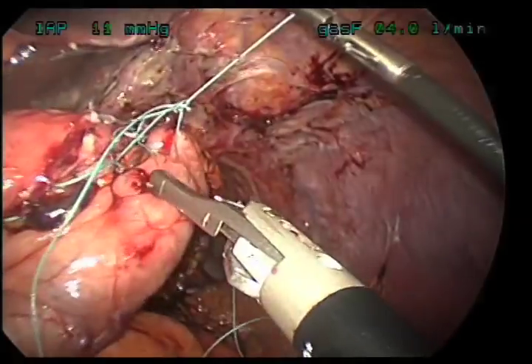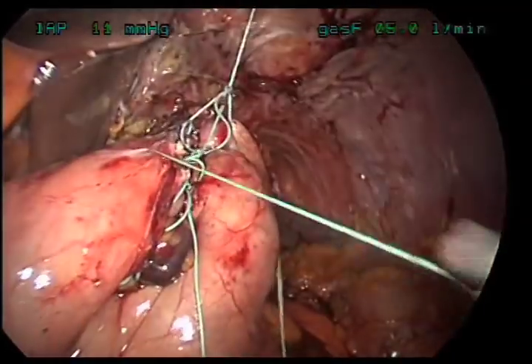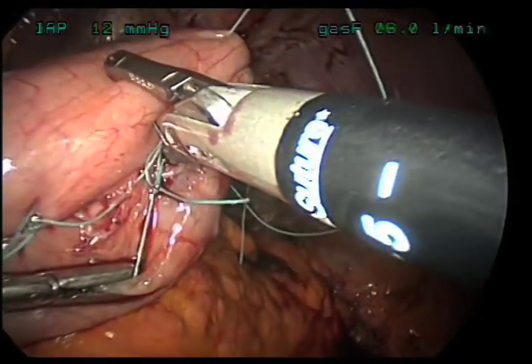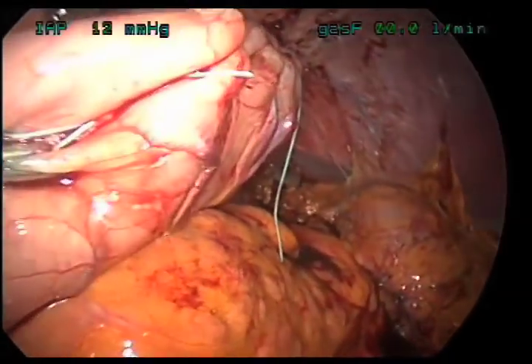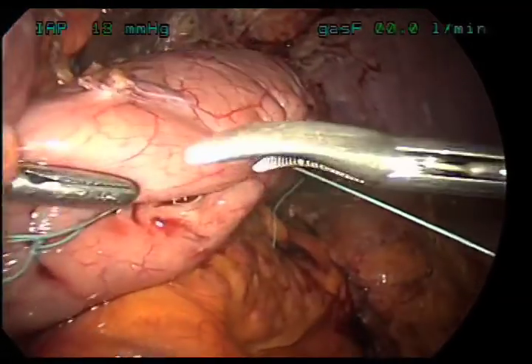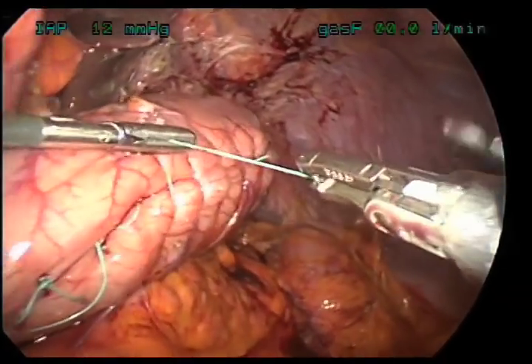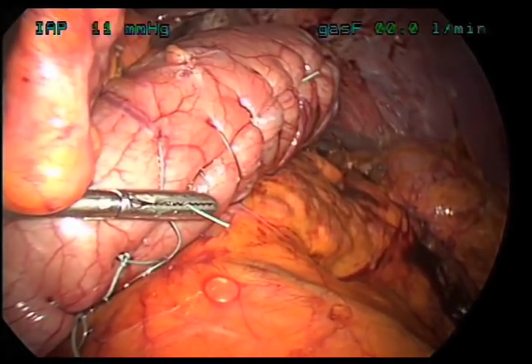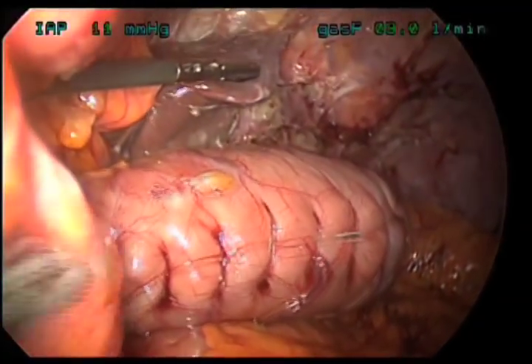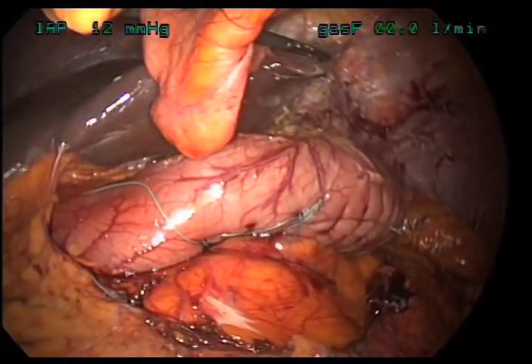Here's the final interrupted suture as we go down the stomach. Now we're going to follow this up with a running suture — a running suture starts at one point and goes without stopping for quite a distance — and we're folding more stomach in on itself. If the patient couldn't tolerate the procedure or had nausea and vomiting after surgery, to reverse this all we would do is go back and cut the suture and the stomach would return totally to normal. Inside the stomach we've placed something called a bougie — a device that stents the stomach open so we can't suture it down too tightly. You can see the nice line created and all the expansion portion of the stomach has now been taken away, lying very nicely with the sutures out of the way.